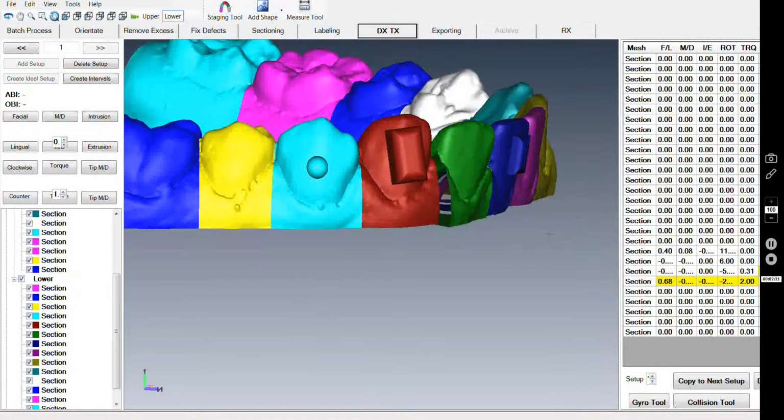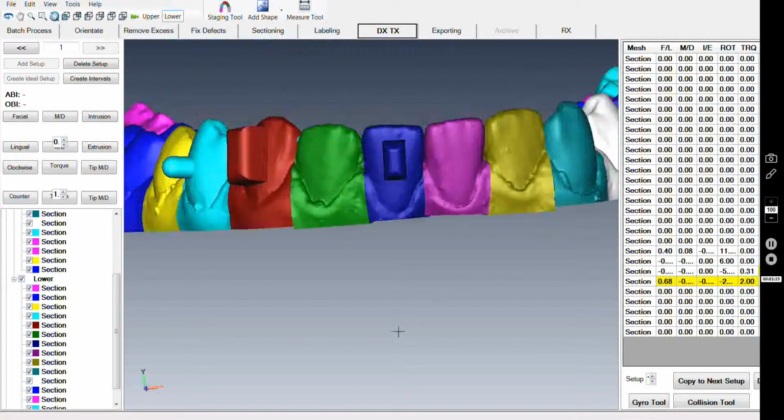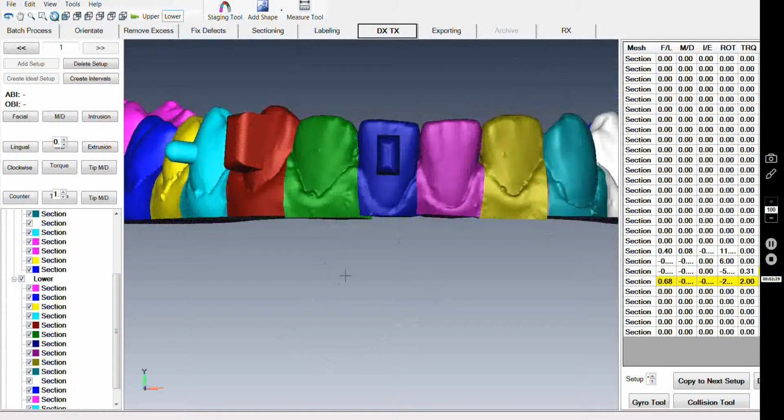Okay, so hopefully this is helpful. This is just a real brief introductory video. The second video goes in a little more detail on how we actually use the attachments in terms of the biomechanics and the forces applied. Okay, hopefully this is helpful, and have fun.